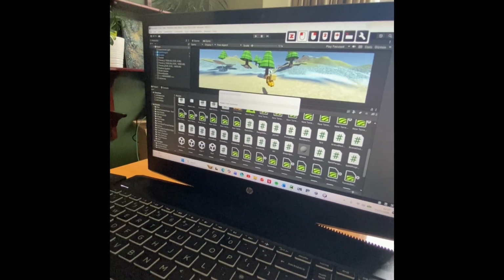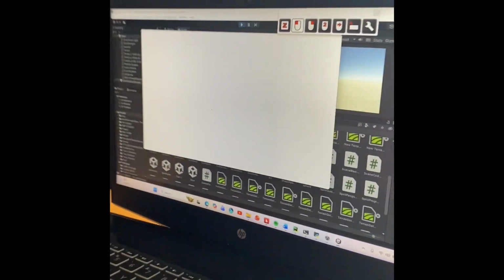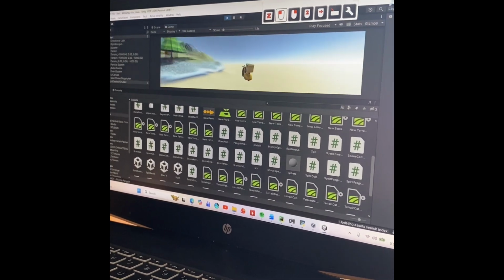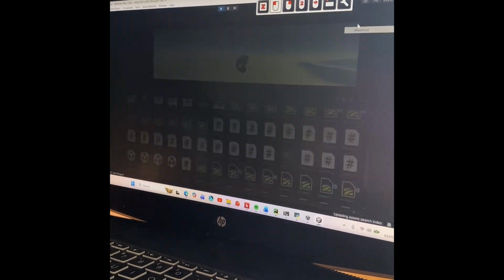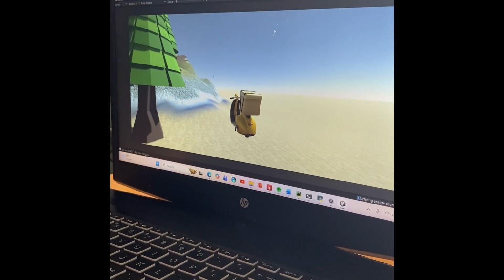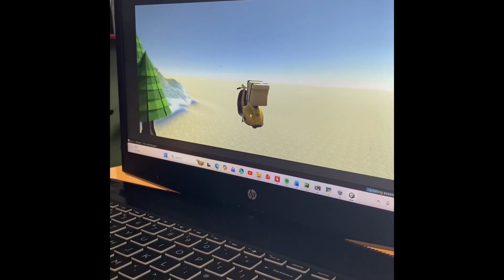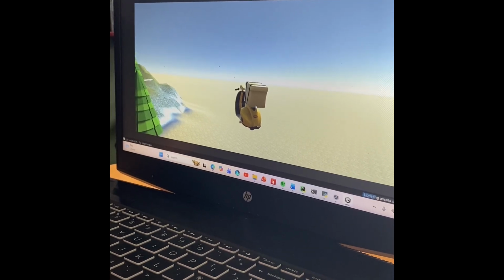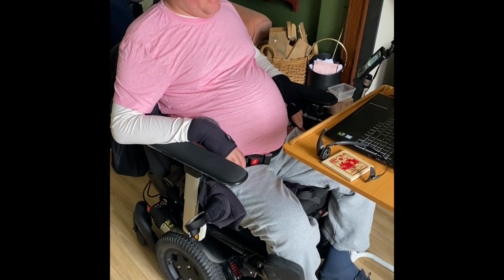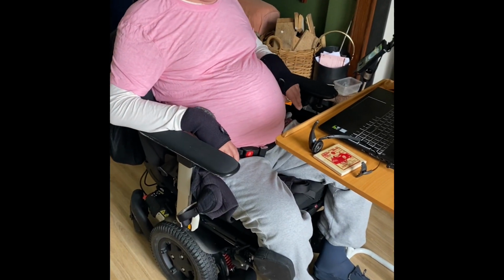If I press play here, the scooter is actually, let me just maximize the screen. So this is my scooter. So I have a dead zone in the middle where if I hover it doesn't do anything. I haven't closed that down. Alright, we'll start this again. Okay, that was a demonstration of how the robot or the wheelchair will function in a 2D plane.